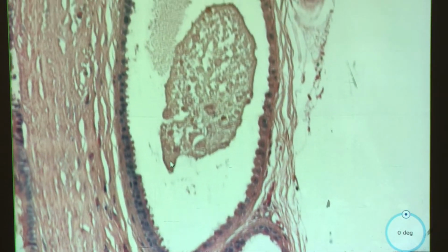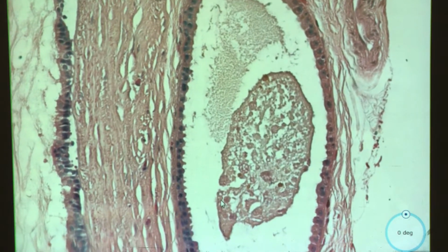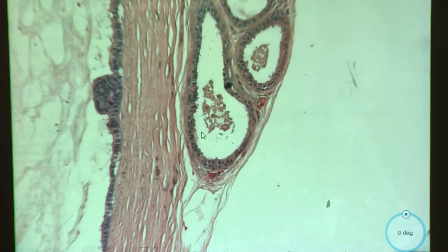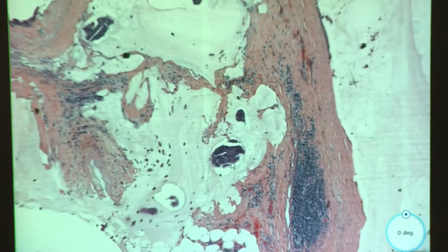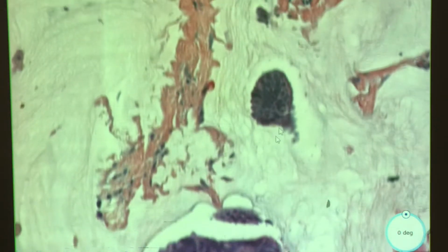Ooh! Oh, look at all that apical snouting. No, we're left off though, so I'm going to leave that alone. I really don't like calling FEA if it's not really there. But yeah, this is atypical.